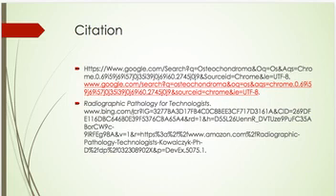In this unique case, I have learned increased technique for osteochondroma pathology. I have learned more information about osteochondroma, and I can see it from the radiograph.